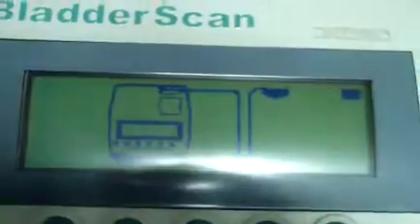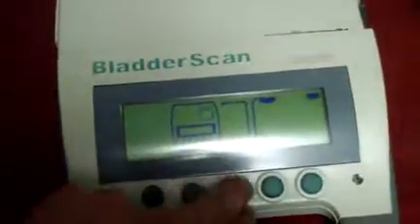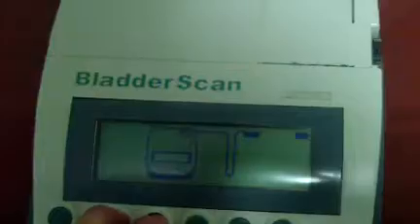Disconnect and reconnect. Make sure you click in there. So it seems like there may be some type of issue.